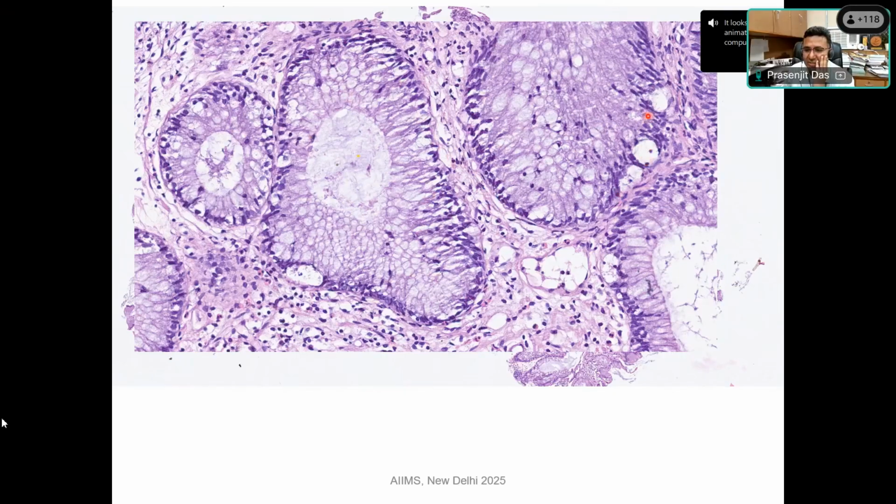And what are these areas showing? These clear bags with some structure in their cytoplasm. Can you see here within the epithelium? What are these? Anyone? These are the apoptotic bodies. So we are seeing lymphoepithelial lesion and a lot of apoptotic bodies. So any clue? So this is a chronic disease. Yes, Dr. Shilpi told it is apoptosis, correct, with lymphocytic infiltrate, and they are causing cell damage. So it is not just a bystander.